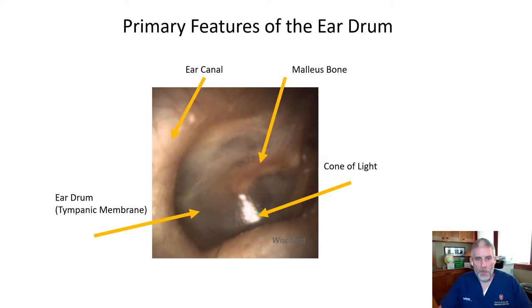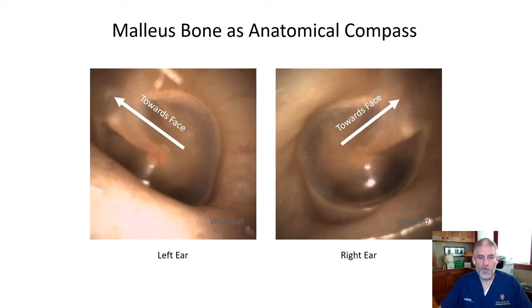The last primary feature of the eardrum that you can almost always see is the malleus bone. The malleus is the first bone in the chain of three bones that communicate the movement of the eardrum to the inner ear. It is attached to the eardrum and moves with it. One of the great things about the malleus bone is that it serves as an anatomical compass — you can always tell which ear you're looking at. The malleus bone always points towards the face. In the left ear, the malleus goes from the center of the eardrum up to about the 10 o'clock position. For the right ear, it goes to about the 2 o'clock position, again pointing towards the face. This is one of my favorite features of the malleus bone, and one of my favorite quizzes to give medical students or residents.